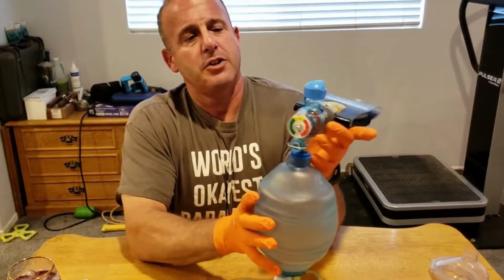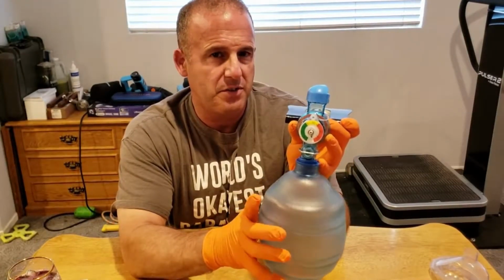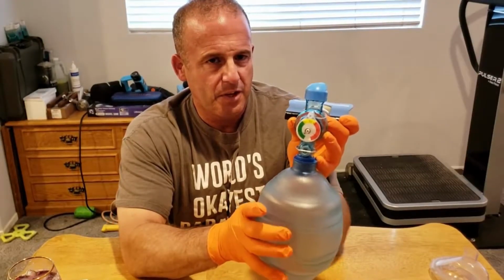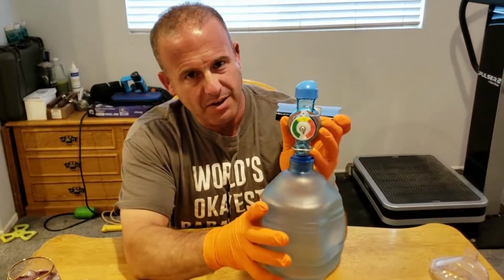Say now, I just use one hand, which fits within the guidelines of approximately 300 to 500 cc's of air for a typical adult. You'll notice, let me make sure I'm not lying here, my pressure stays down in the green.